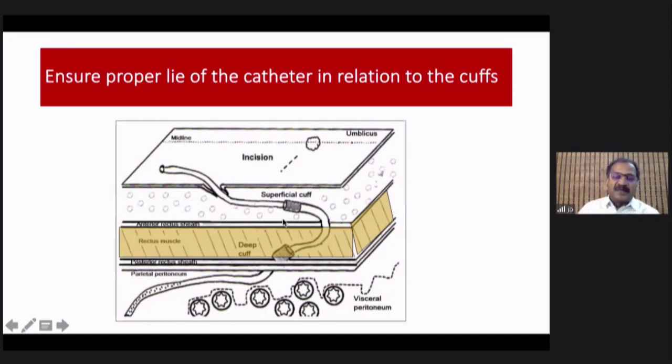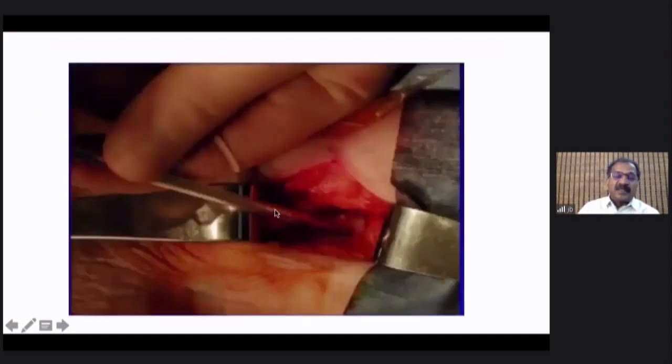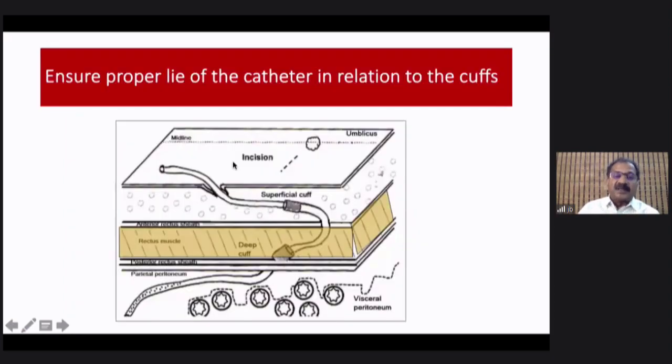One simple method will be, from there you can put in a needle, a needle puncture, and put in the guide wire. And if you had already pre-planned and avoided the epigastric artery, that is fine. But as you get more experience, you can open the anterior rectus sheath transversely again and see the muscle layer, separate the fibers, and you can see the posterior rectus sheath, a glistening sheath like the anterior sheath, and there you can put in the needle again.